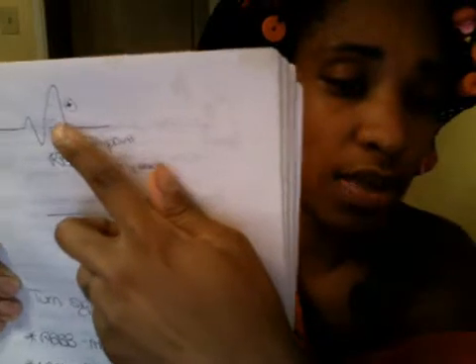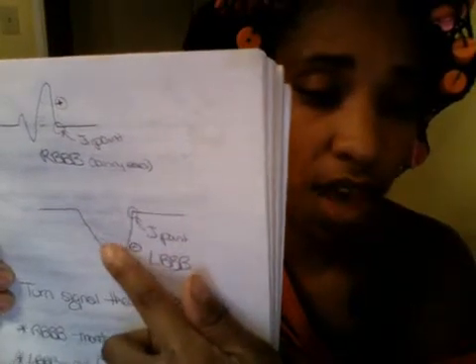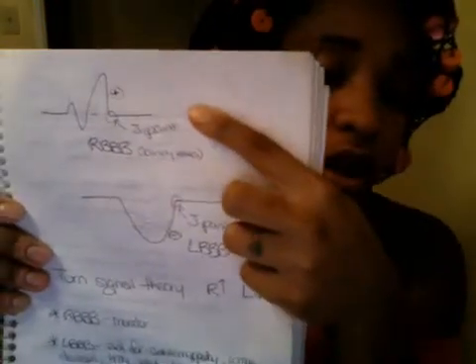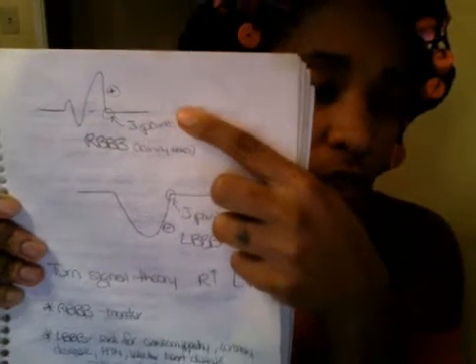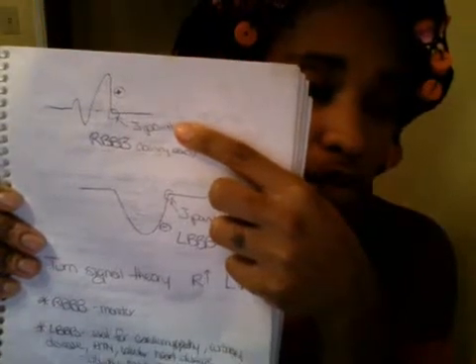You're looking basically to see if it's positive, then it's right. If it's negative, like going beneath the isoelectric line, then it's left. You use your J point as a reference point of how to measure it. And then I understood, when I saw this, what they were talking about with the bunny ears. So I guess their assumption is if it's a right bundle branch block, it will always have bunny ears. I don't know if that's necessarily the truth.